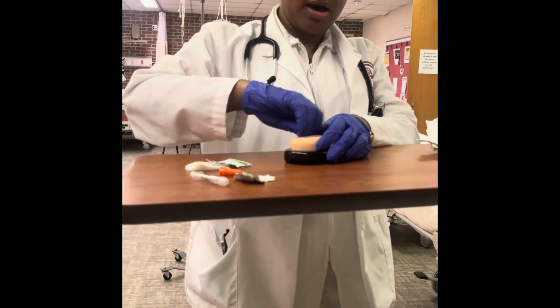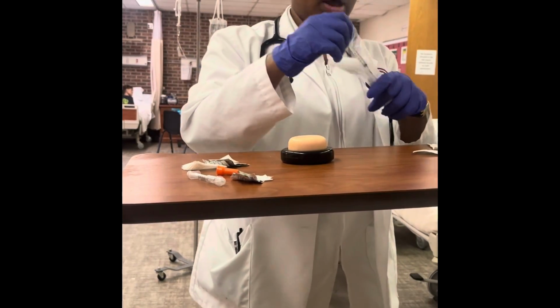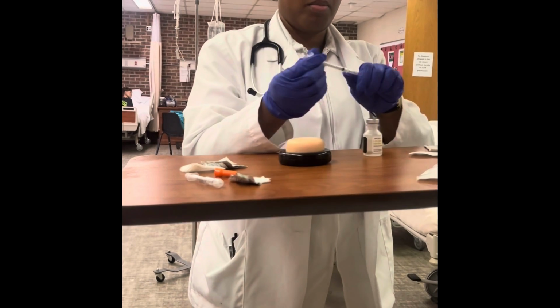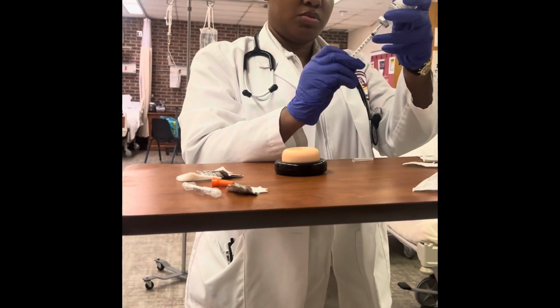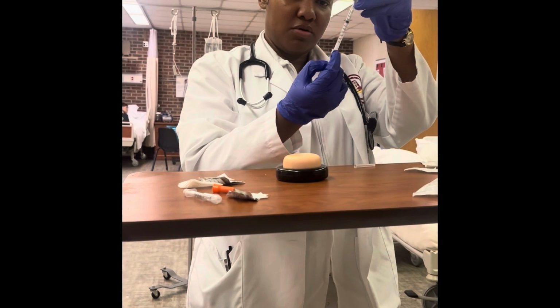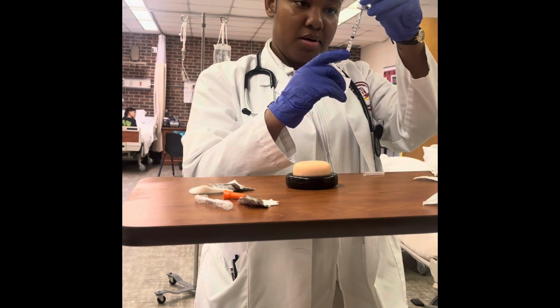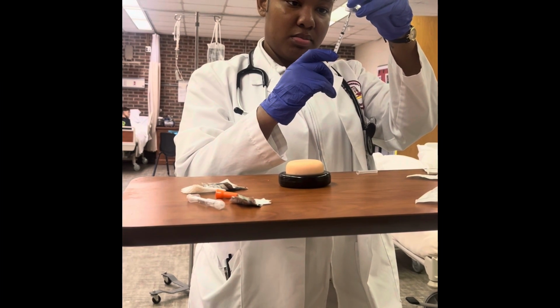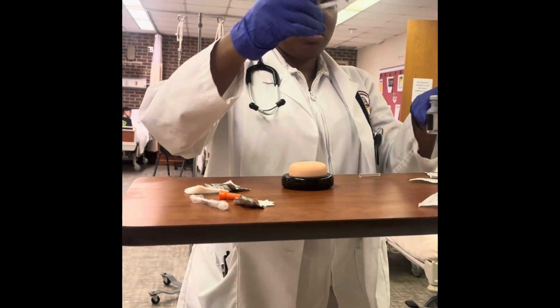Clean it inner to outer fashion. And as I let that dry, again, if your medication isn't already pulled, I can go ahead and get it ready at this time. Careful. Pull the ordered amount of medication. Aspirate. Make sure you get all the air out.